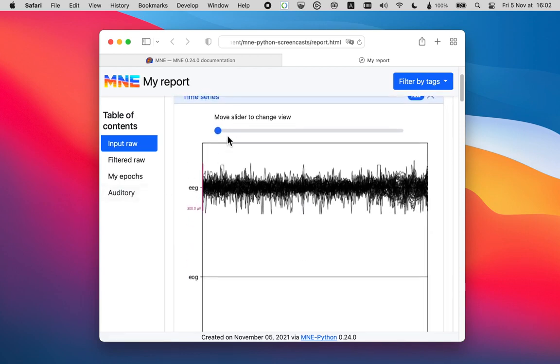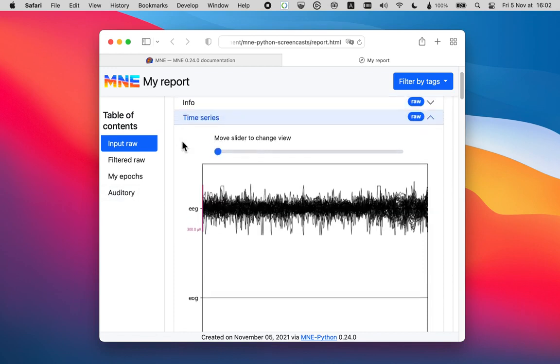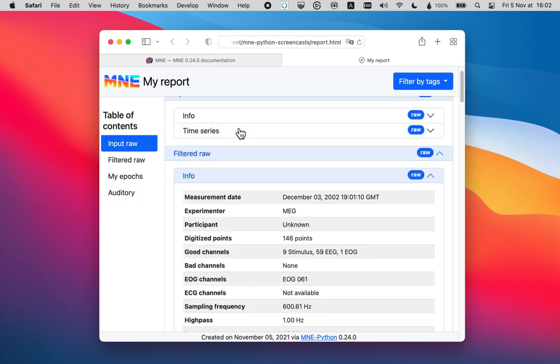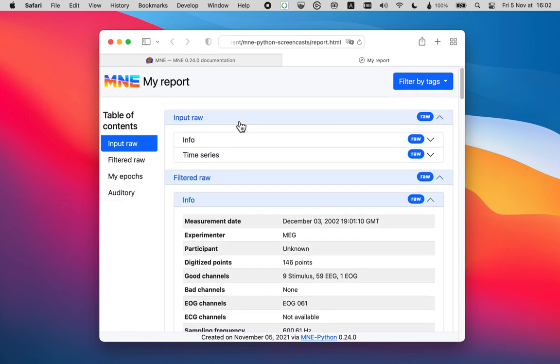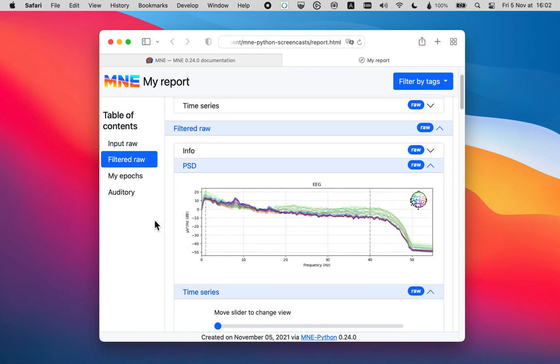Get a view of the time series. Just going to close this. And let's move on to the filtered raw. Because here we should have a PSD figure. Here it is. And we can see that filtering actually did have an effect. And the line noise is gone.